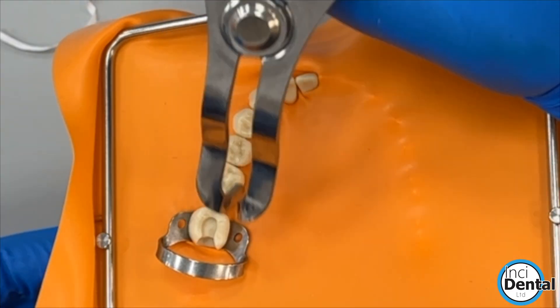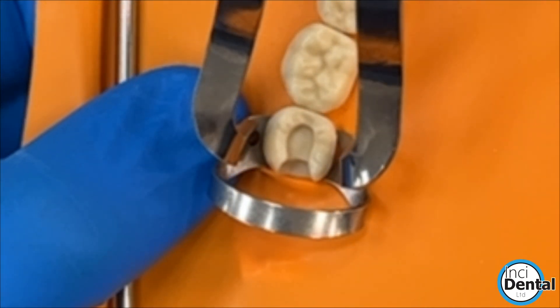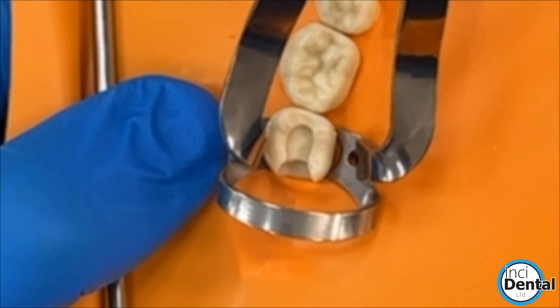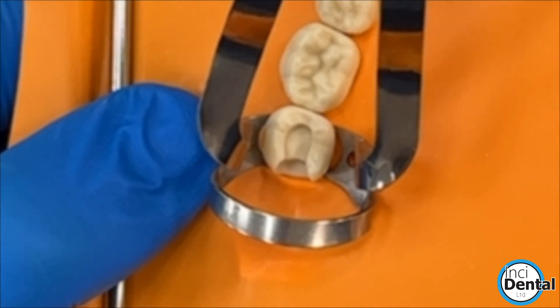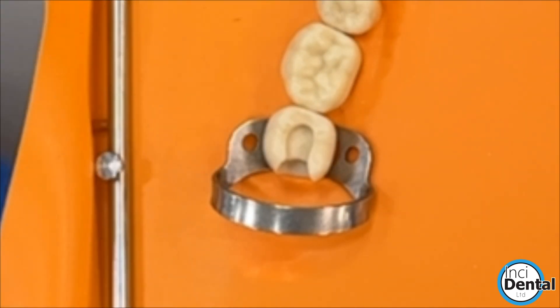We finish the isolation by just rocking the clamp. Here we're going to open, lift one side, lift the other side to finish.